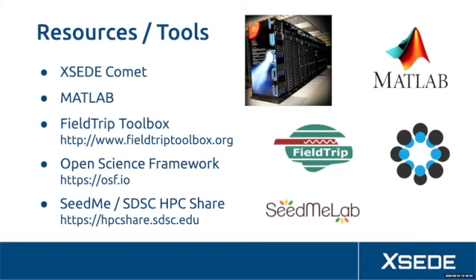Here are some of the resources and tools that we used. We processed most of our data on SDSC's Comet in interactive mode. I think everyone knows MATLAB, and we use that for most of our data processing. FieldTrip is a MATLAB toolbox. It's open source, and it's meant for EEG, MEG, and other modality analysis.